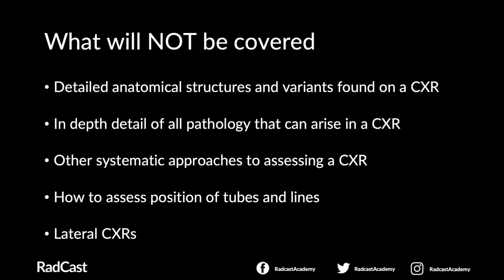So it's important to detail what is not going to be covered. Detailed anatomical structures and all the variants found on a chest X-ray will not be covered. An in-depth detail of all the pathology that can arise in a chest X-ray will not be covered in this presentation. We know that there are other systematic approaches to assessing a chest X-ray. However, we will be referencing the Dr. ABCDE method for this presentation.